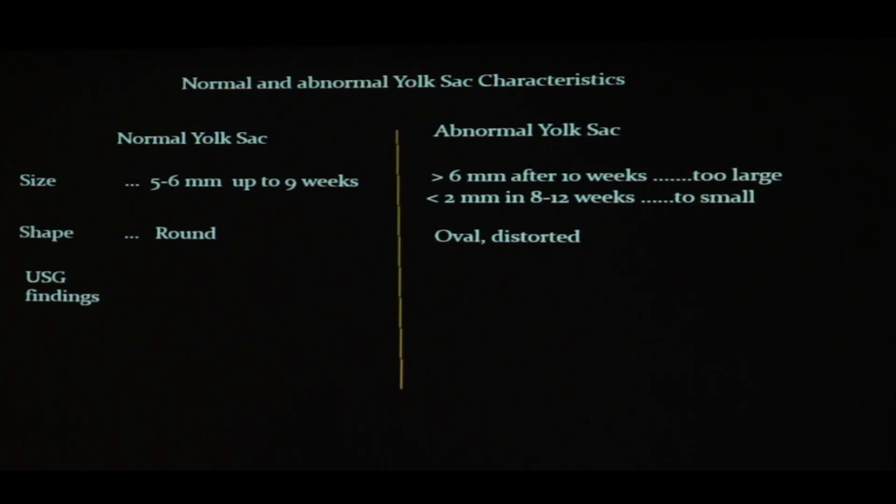Why am I using the word hypoechoic here? Because I am comparing it with the next structure. What is here? Here is the wall. The wall is very much reflective, echogenic, and the center should be jet black, not hypoechoic, because the hypoechoic here is the comparison anechoic. So hypoechoic center in comparison with this wall. So the wall will be this whitish shade, that is an echogenic rim with a jet black center. You can take it like this.